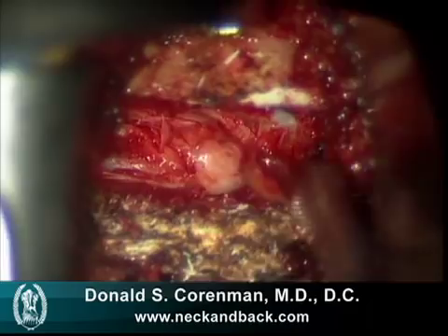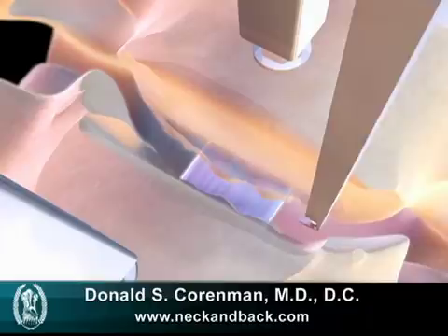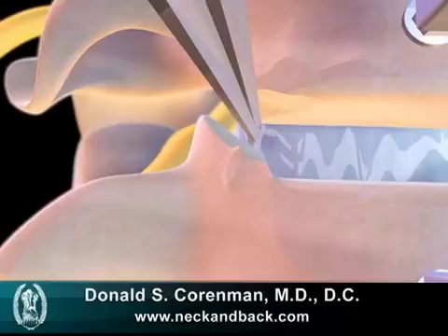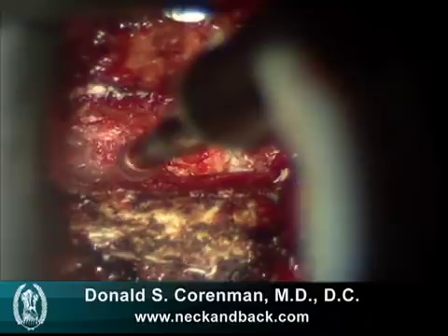We then work on the back spurs that are projecting into the canal, and we use a small tool called a Kerrison as well as a curette. The uncovertebral joints are the areas of the bone that create the spurs that compress the nerves, and here you see them removed with a Kerrison. The Kerrison will remove these and make more room for the nerve, which you can see in the background. You can also remove the spurs with the high-speed burr, and this thins down those spurs enough that you can easily pull them into the disk space using a small up-angle curette.